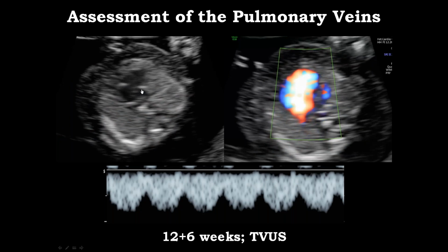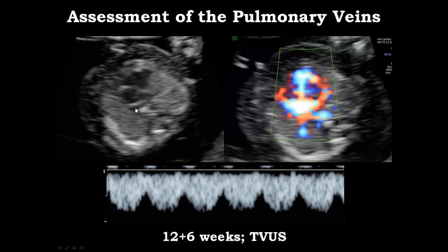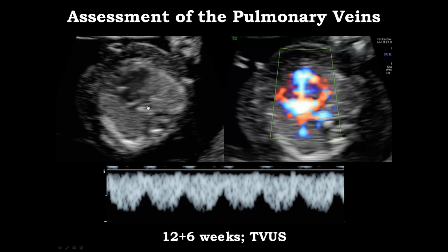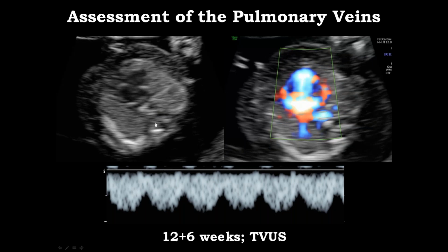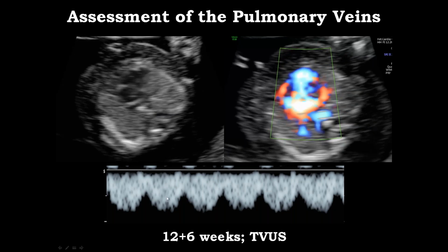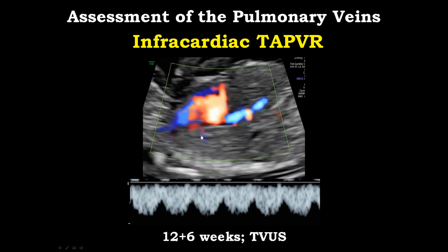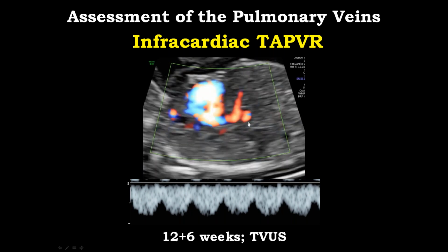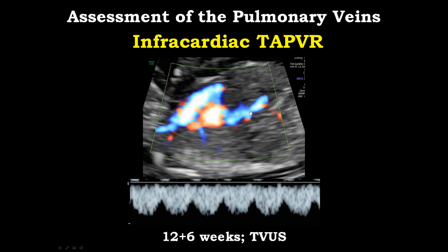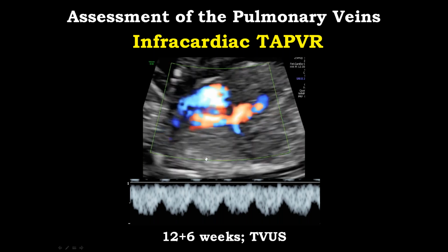Here you can see the abnormal appearance of the four-chamber view, but in 2D we also saw some structure that appeared vascular, and using color Doppler it looked like a twig sign, and this is a typical view for an abnormality of the venous return. So we Dopplered this vessel and realized that this is really restricted blood flow, and using the sagittal view we confirmed that this is total anomalous pulmonary venous return. There is drainage of that vertical vein to the portal vein system. In this pregnancy, that diagnosis was made as early as 12 weeks and 6 days.